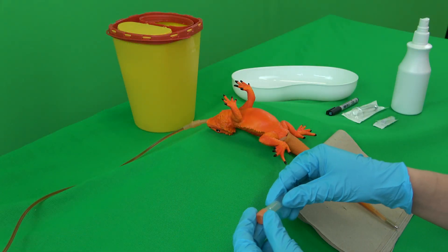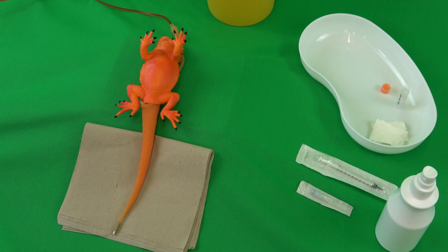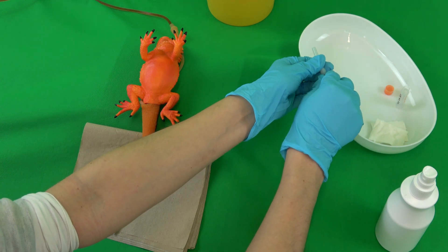First, all the necessary materials are prepared and placed within reach. The sample vial is labelled and the cannula is set on the syringe. Both are placed in the kidney dish until needed.